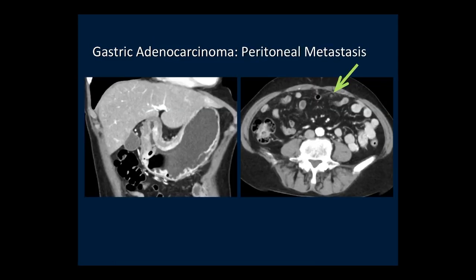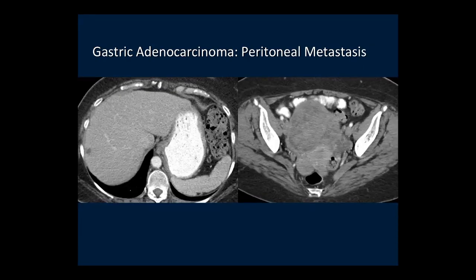The tumor may also spread to the peritoneal cavity. In one patient, we see circumferential wall thickening of the antrum, abnormal enhancement, and a small nodule in the omentum representing peritoneal metastasis. Peritoneal metastasis may implant on the ovaries; these are called Krukenberg metastases. In another patient, we see large bilateral ovarian masses, thickening of the gastric wall, and a liver metastasis in this patient with gastric adenocarcinoma.